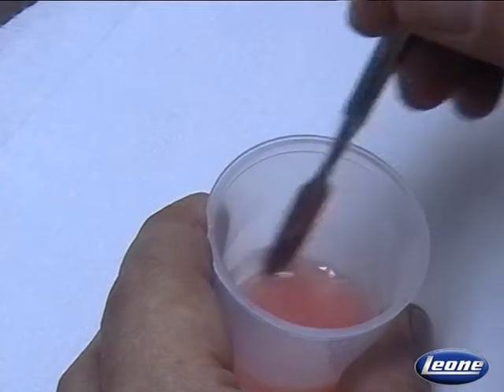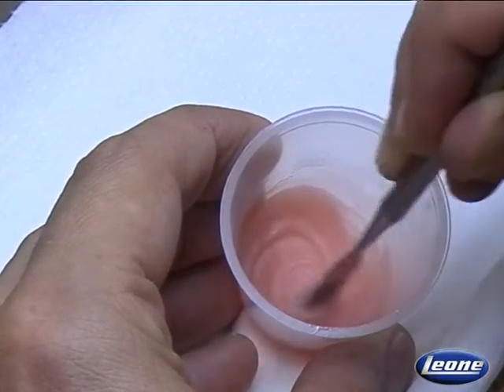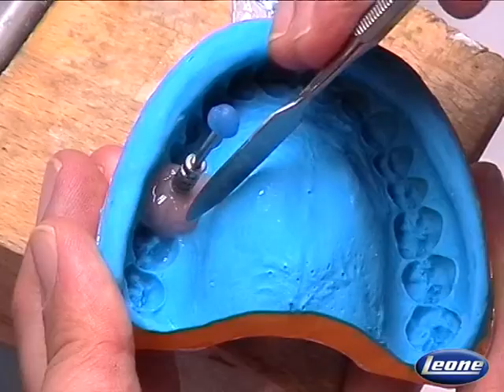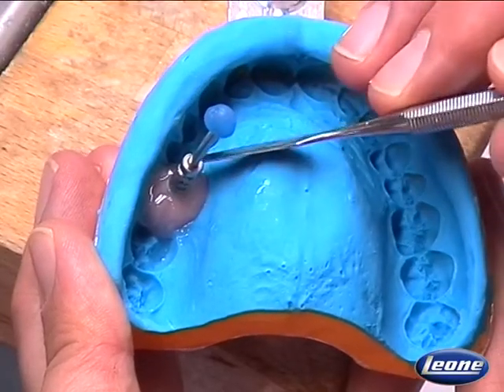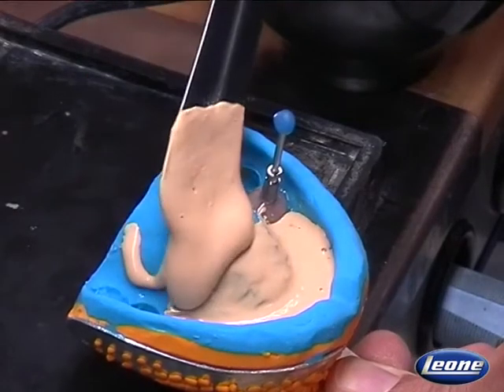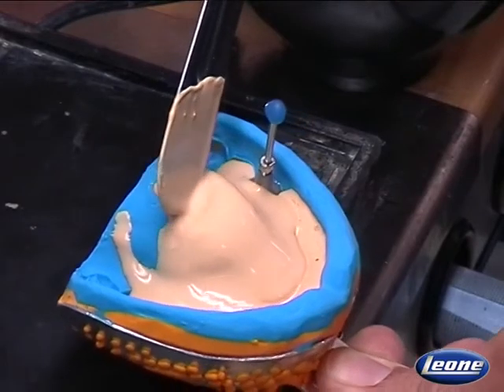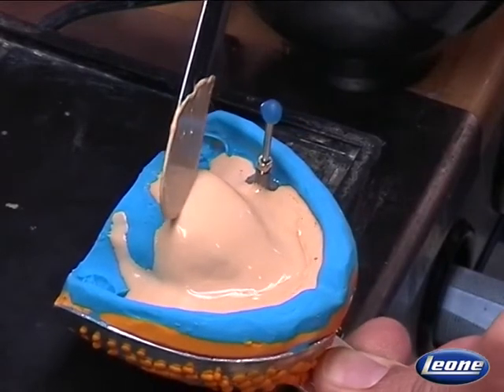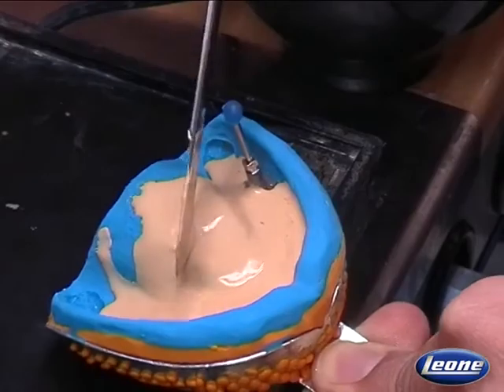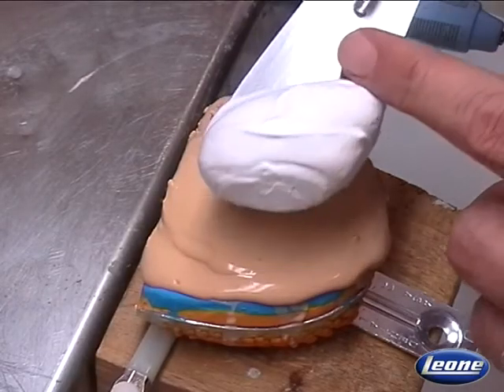For gingival reproduction, you can use a rigid silicone. For example, Gingifast Rigid. Pay attention not to change the position of the pin while pouring the plaster. You should use a good plaster, for example, a plaster class 4. For the base, you can use a white plaster class 3.